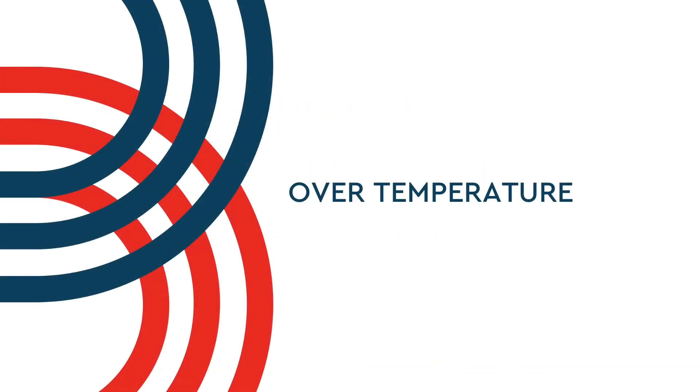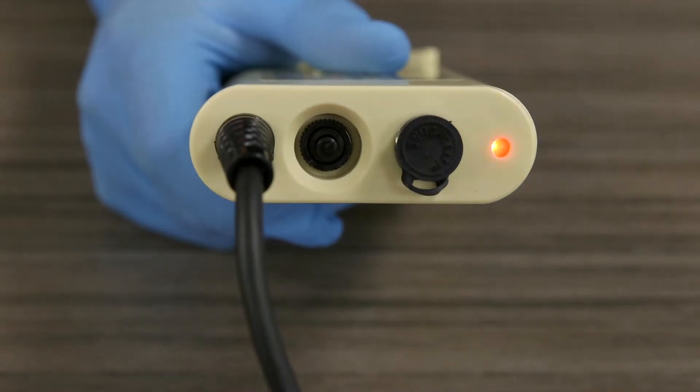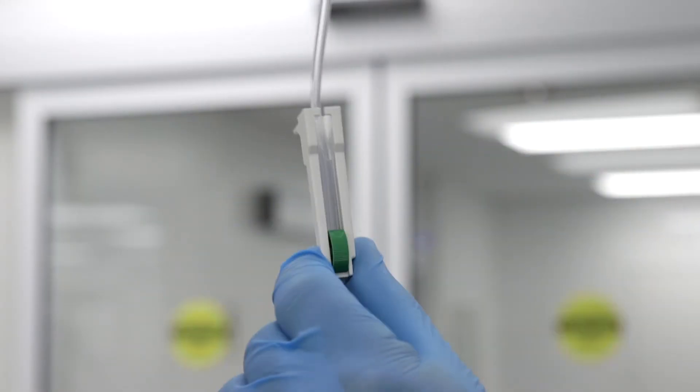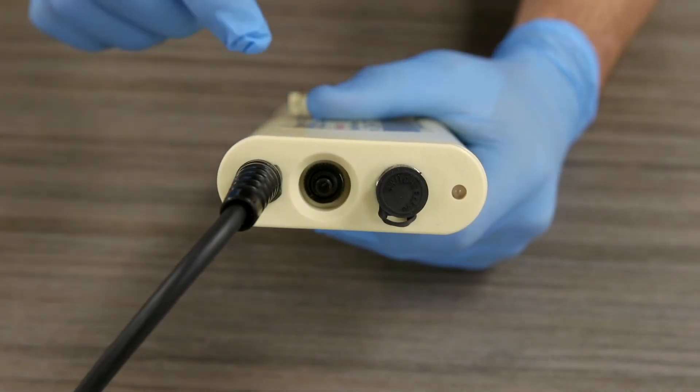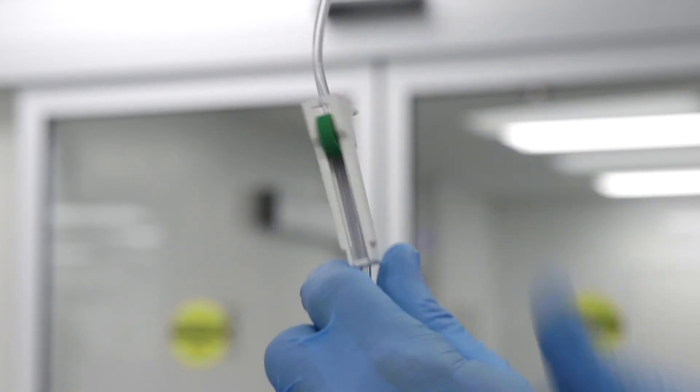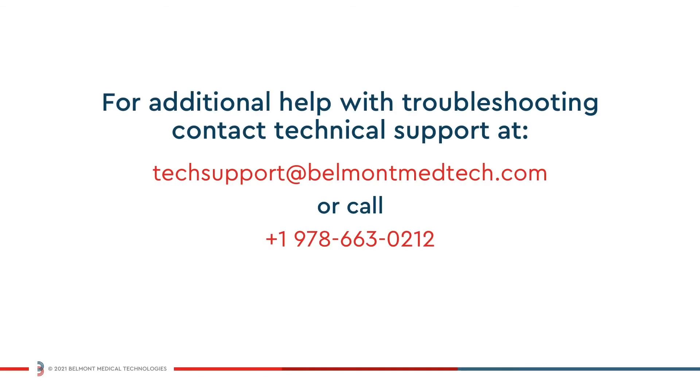If the system detects an overtemperature, the system will stop heating, blue and red LEDs will flash, and an audible alarm will trigger. An overtemperature alarm may be triggered by repeatedly stopping and restarting infusion during high flow conditions. To resolve the condition, clamp off the line and repower the system by turning the unit off and then back on, then unclamp the line to restore flow. If you are unable to resolve an alarm condition after performing the corrective action and repowering the device, or if the system fails to power on during setup, please contact customer service for assistance.